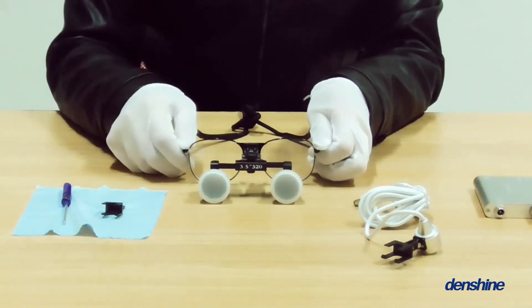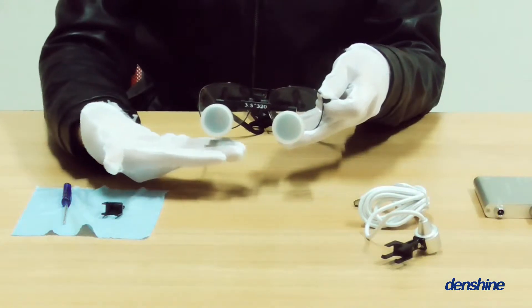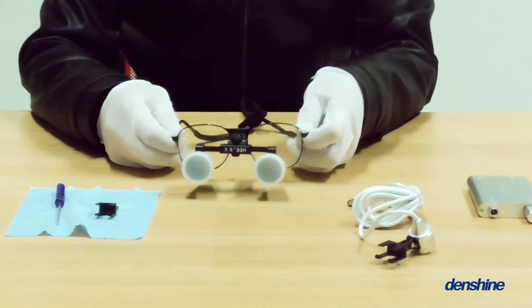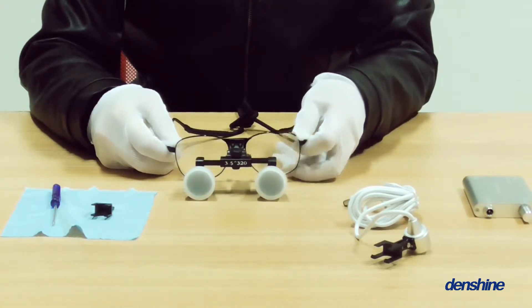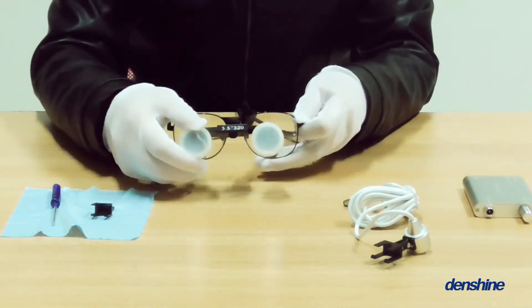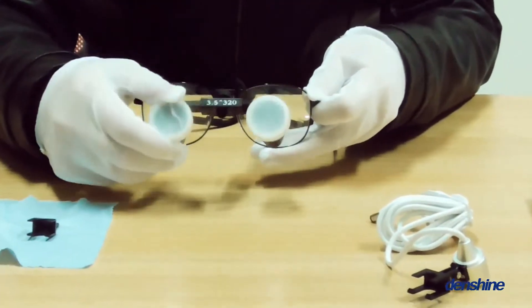Magnification: 3.5x. Working distance: 320 mm. Depth of field: 80 mm. Field of view: 60 mm.